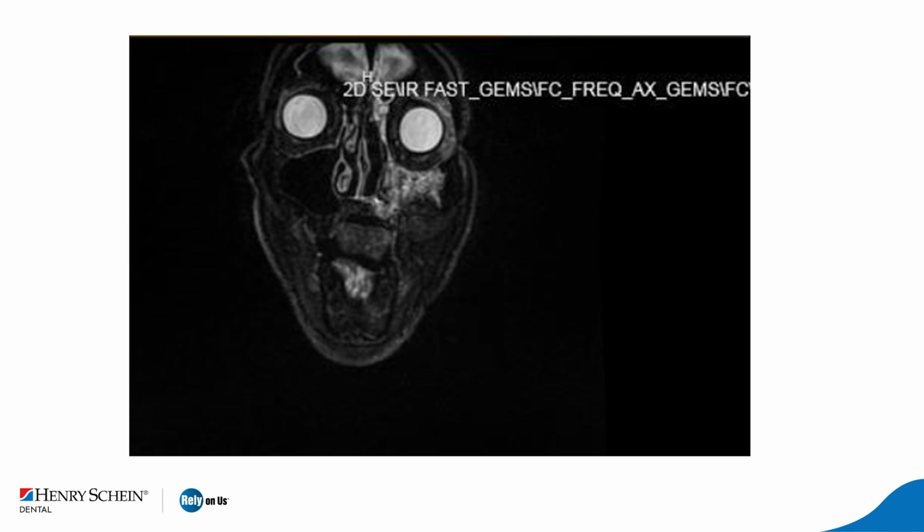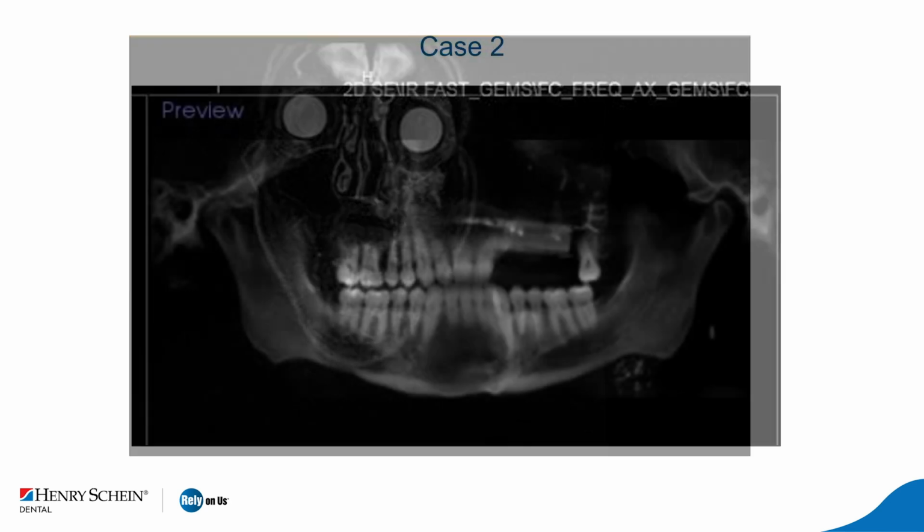So the eye is starting to sink in. We call that enophthalmos. And you can also see that the left aspect of his nose demonstrates erosion too, and the inferior concha is missing, as well as the middle concha or turbinate. So the cancer had a free empty cavity, so it was very happy and could expand and get bigger because it doesn't face too much resistance from the surrounding structures, and those can get pretty large.